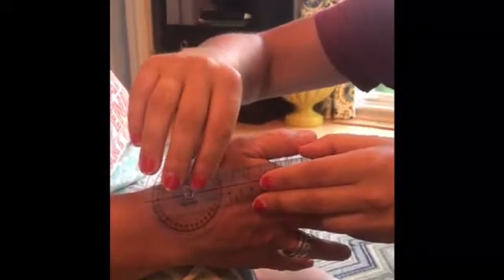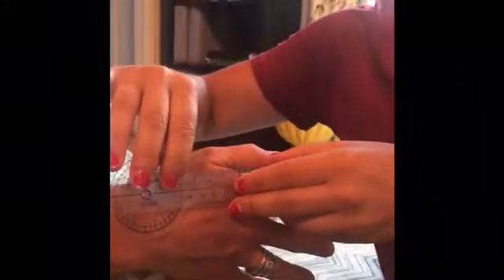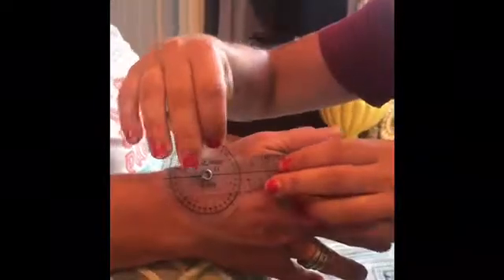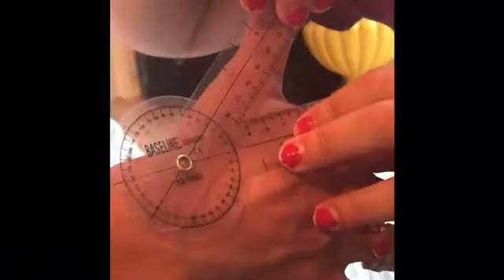We're going to be measuring the thumb CMC joint palmar abduction. Typical range of motion is 0 to 50 degrees. Your axis is going to be over the CMC joint at the base of the thumb metacarpal. The stable arm is parallel to the second or index finger metacarpal, and the moving arm is parallel to the first or thumb metacarpal. So go ahead and... it is at 40 degrees.